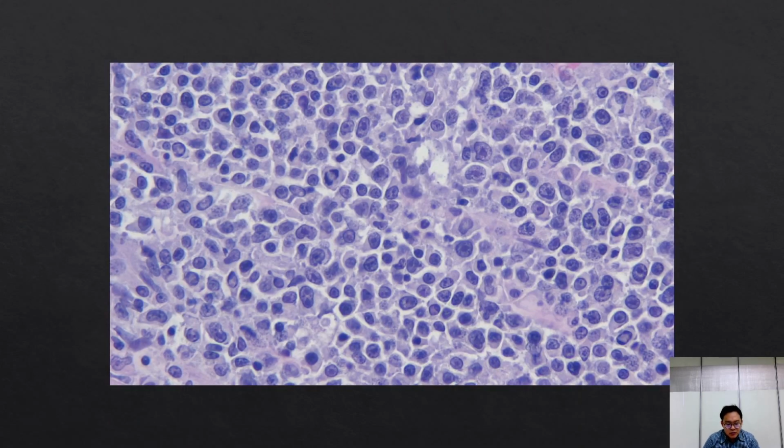So we can diagnose lymphoma, but if we want to know if it's from a T cell or a B cell, which ends up being important sometimes for prognosis, and how the oncologist might deal with that patient, we can use IHC to determine the origin. In this case, we would use two different cell markers, one that labels the T cells, and one that labels B cells.